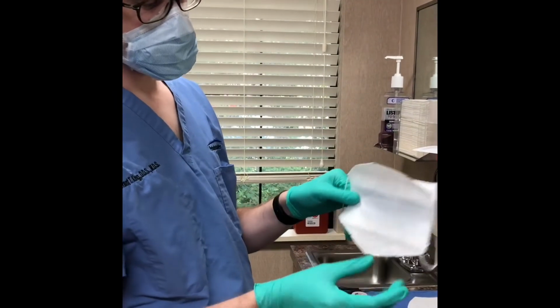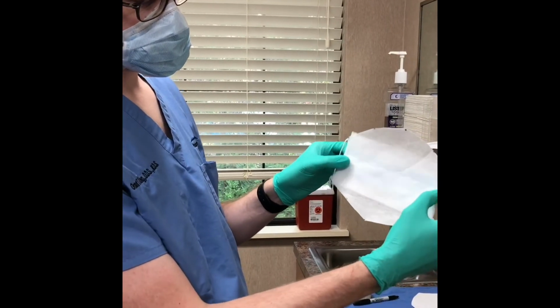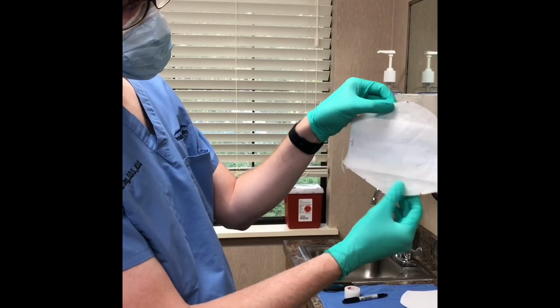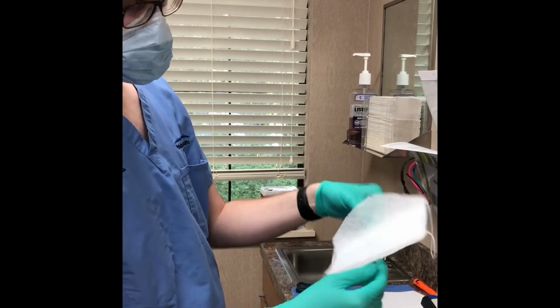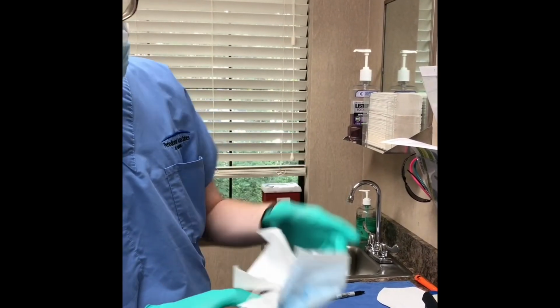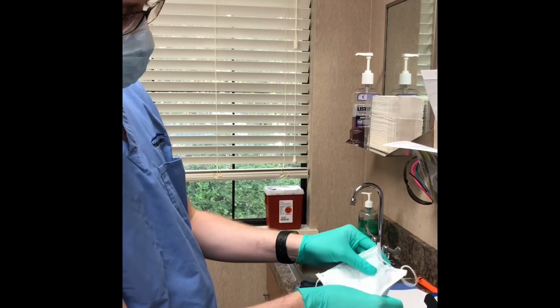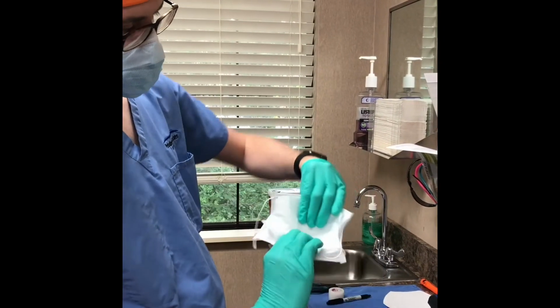So I use the stencil, cut out a piece of material, and then I'm going to staple it on the sides. Make sure you line up the edges, make sure that you've got about the same amount of material above and below the mask. Then after that's stapled, the staple pointing out, open it up like that, and then just push the material into the mask like this, just so it's lining the interior.